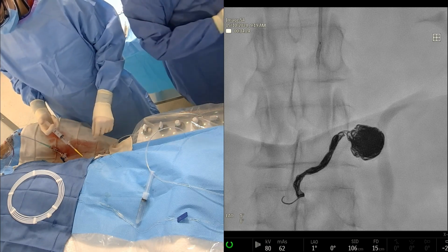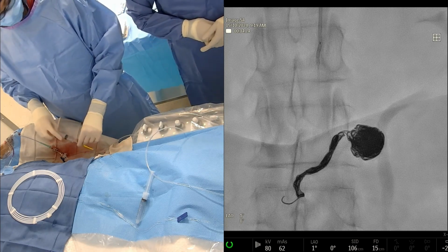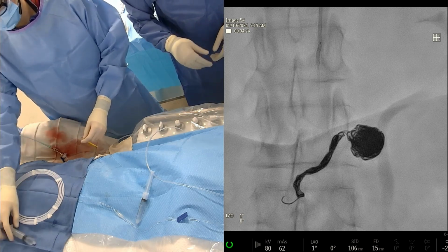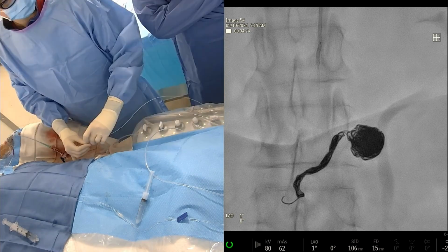It does. I think it also makes the cases go faster. Look, there are other coils you could use. The Penumbra coils are nice as well. For us at least, they're a bit more expensive. So, that would have been good.